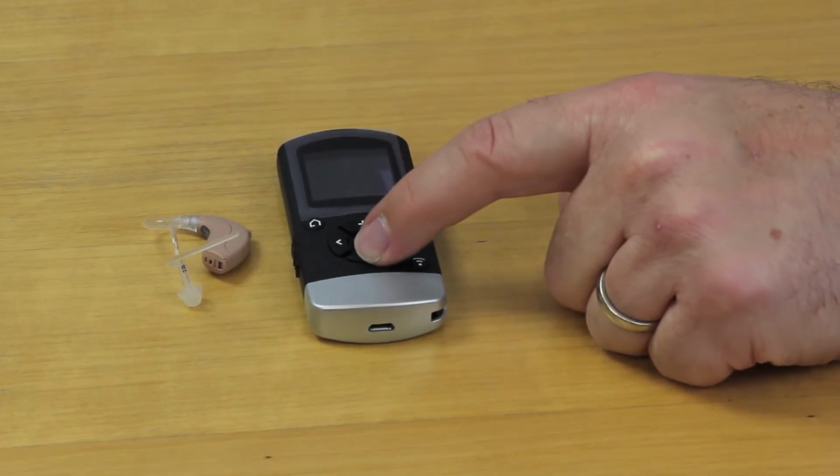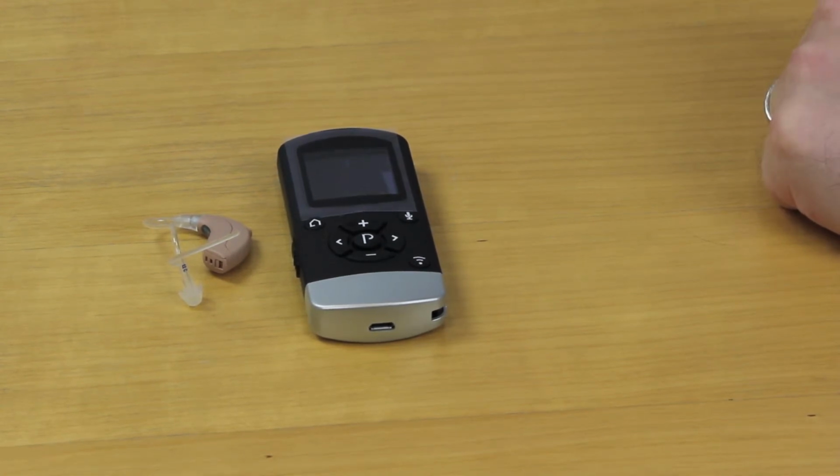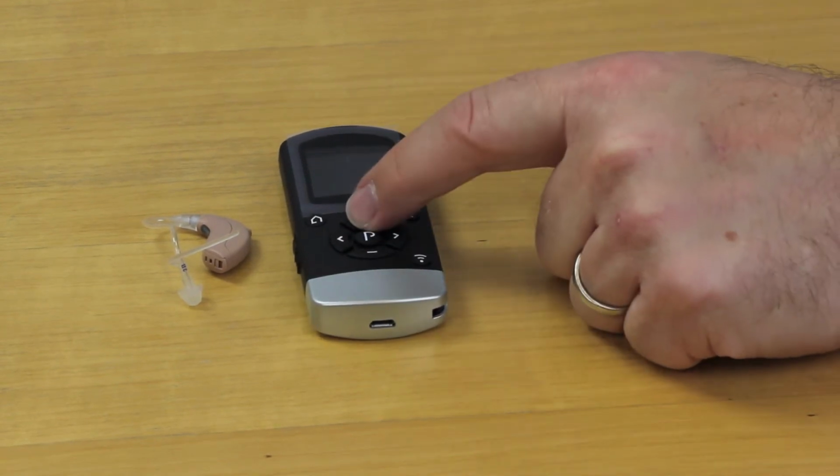If you have hearing aids on both the left and right ears, the remote control will default to make changes on both. If you only want to change one side, press the left or right arrow first, and then the plus and minus keys.